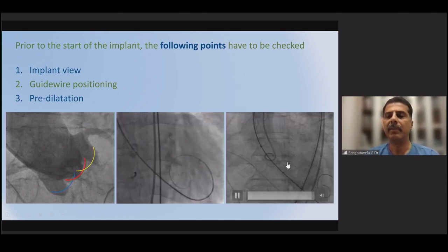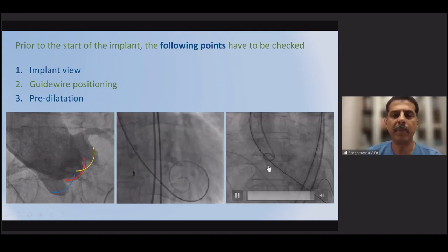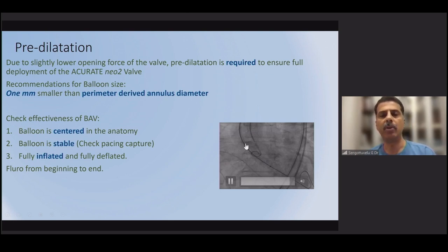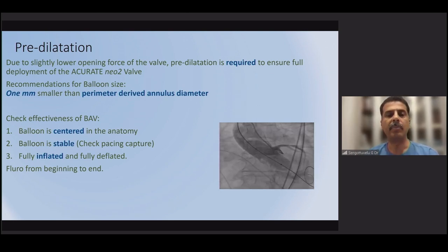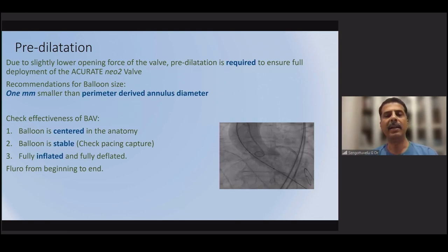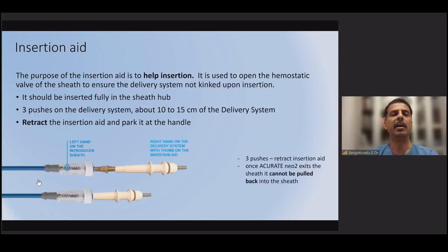A pigtail is placed and balloon aortic valvuloplasty (BAV) is performed. The balloon must be centered in the annulus for adequate predilatation. Predilatation is the most critical step for the Accurate Neo — whether or not you post-dilate, predilatation is mandatory. We use a perimeter-based diameter: take the perimeter-derived diameter, subtract one millimeter, and that is the balloon size. Use good pacing, ensure the balloon is fully inflated, and confirm the waist is completely resolved.